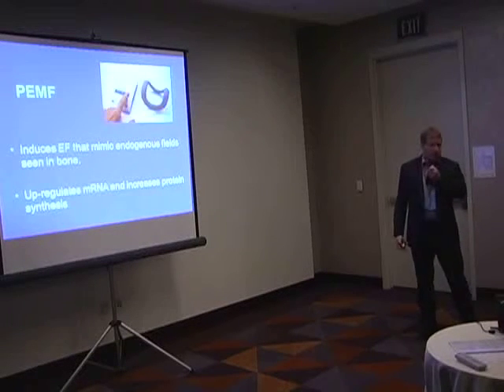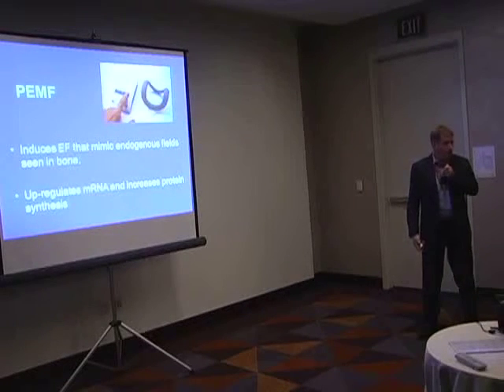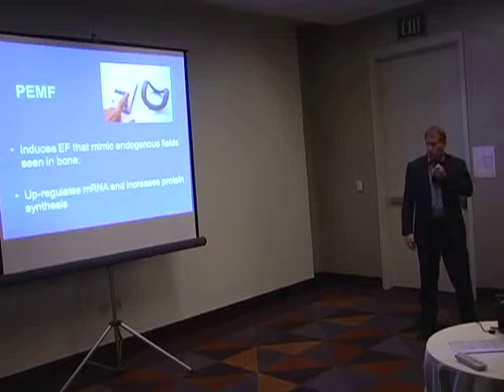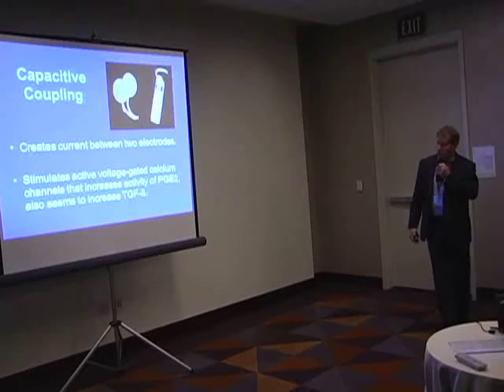The pulsed electromagnetic field device, such as you see here, induces a time-varying electromagnetic field that mimics the endogenous fields that are actually seen in living bone normally and results in upregulation of mRNA and protein synthesis. And this is kind of what the signal looks like in these pulsed devices.